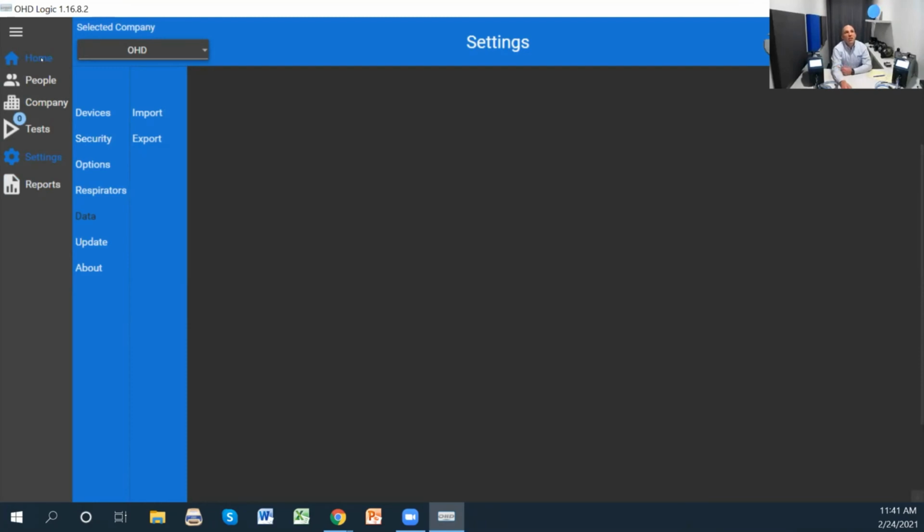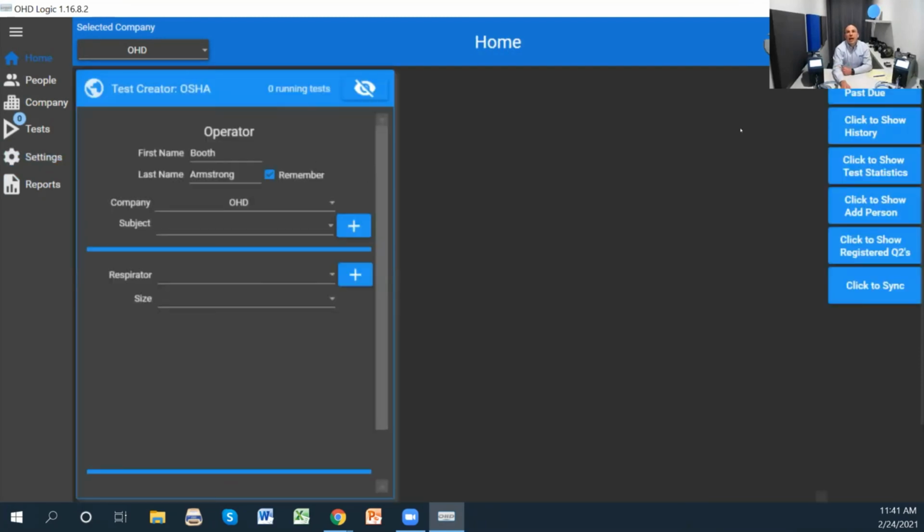So we're going to come back to our homepage real quick and show you the homepage a little bit. This is my favorite aspect of the new software. So you can launch a test from the homepage at any time. Everything you see on the homepage is driven by whatever company you have selected here. So since I have OHD selected, I would be testing people from OHD.